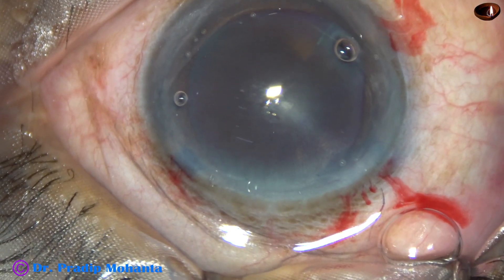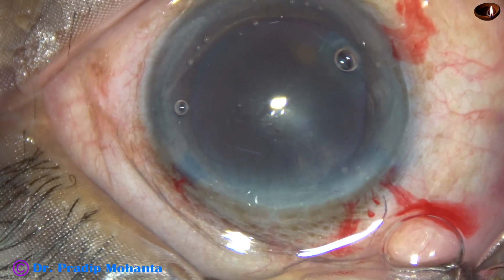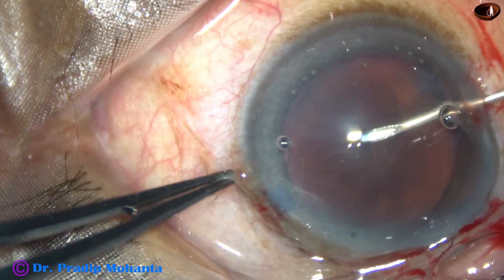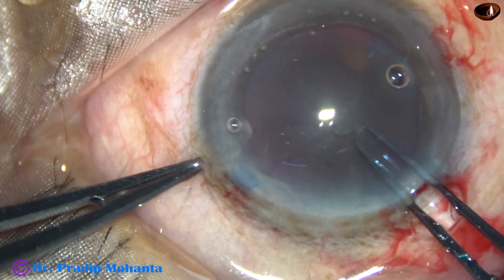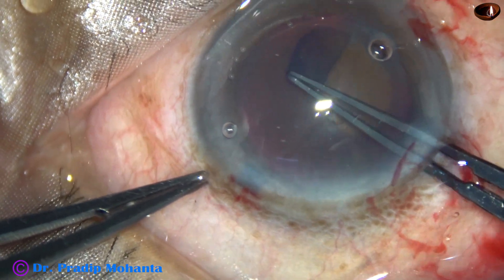The anterior capsule is incised with the help of a 26-gauge bent needle and a large capsular tag, which is very easy to hold, is raised. The Utrata forceps is used to hold this capsular tag.